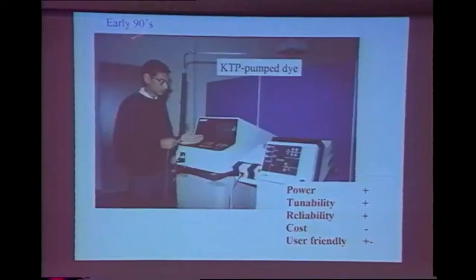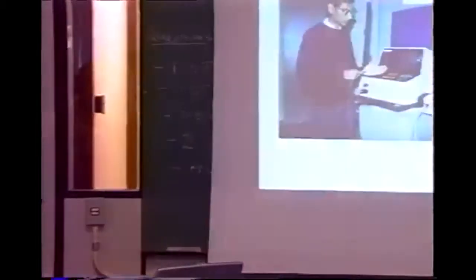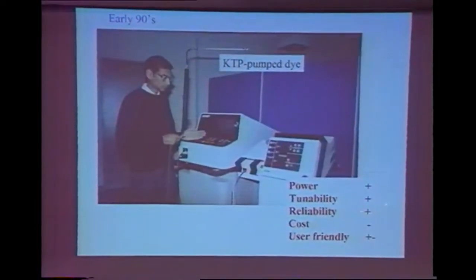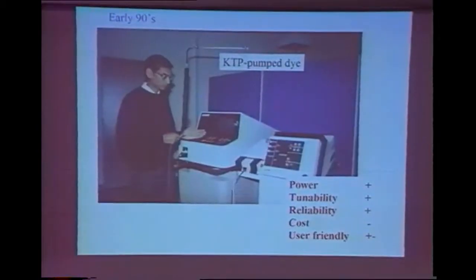In the early 90s, the KTP pumped dye laser was introduced. So this was a frequency doubled neodymium YAG laser, so 1064 doubled to 532. So this is solid state. It still requires a dye laser, but you see it's starting to look more clinical. Good power, still tunable, pretty reliable.